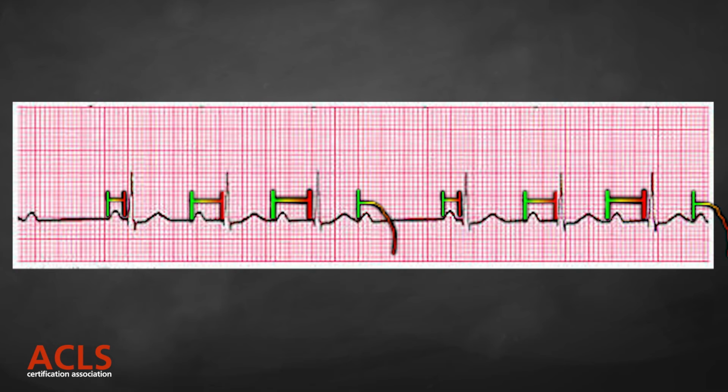That is the criteria we use to determine second degree heart block type 1 Wenckebach.